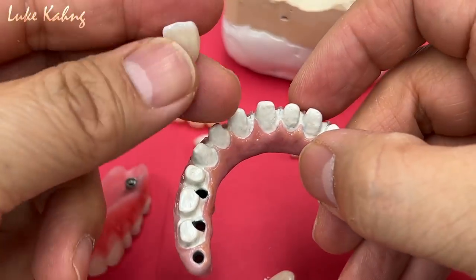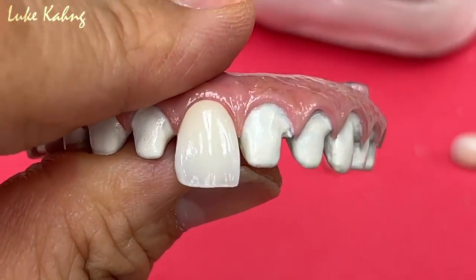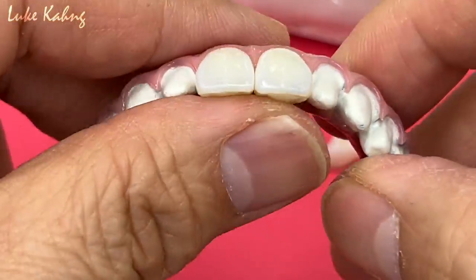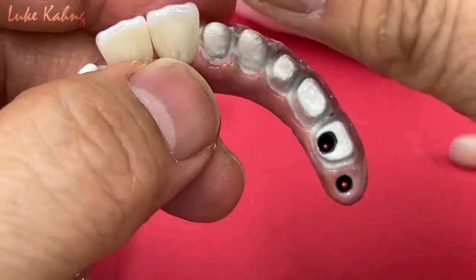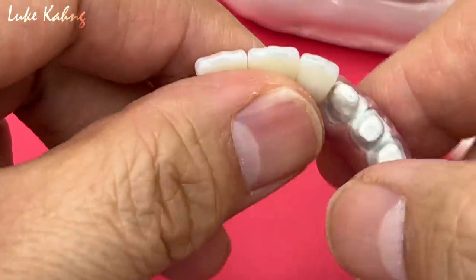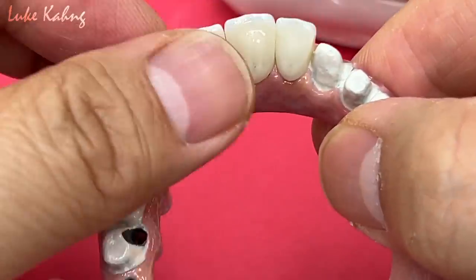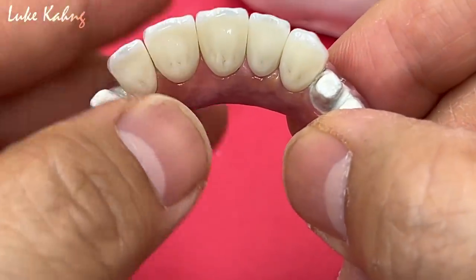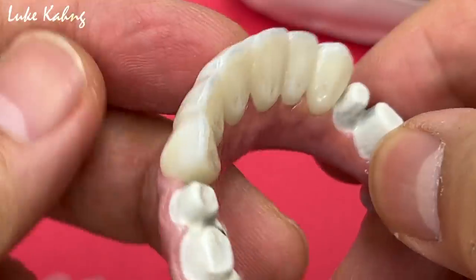Okay, and then we fabricate the micro ceramic, which is a piece of art, individuals. All right, you see the contours, everything just right on. So we're going to cement soon after this. Okay, so 6 units, singles. It's beautiful, right? It's good, it's linear contours.